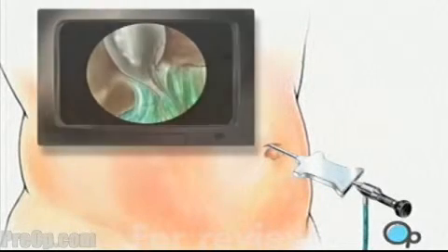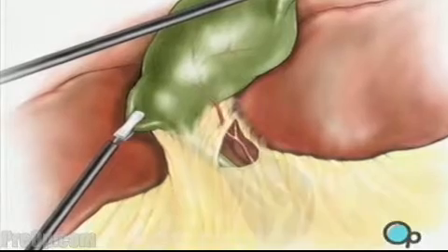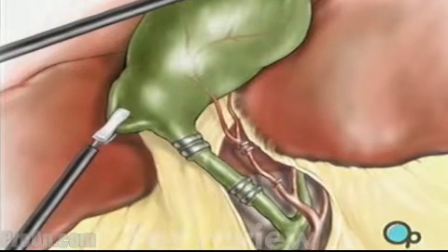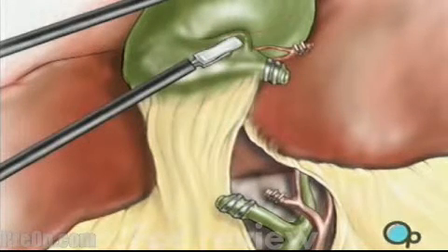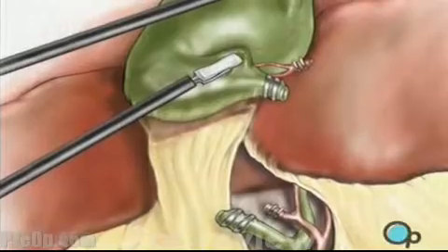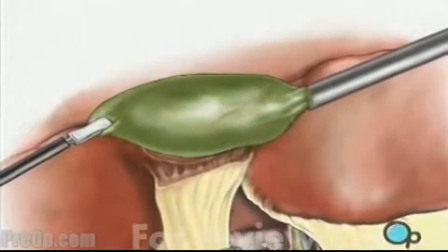Once in place, the laparoscope will provide video images that allow the surgeon to locate and pull back both the liver and gallbladder. Next, the surgeon removes the connecting tissue in order to expose the cystic duct and cystic artery. Using clips, the surgical team clamps off both the duct and the artery, which are later cut to prepare the gallbladder for removal. Finally, any remaining tissue connecting the gallbladder to the liver is cut. The gallbladder is moved into the laparoscopic working port, where it is taken out of the body.